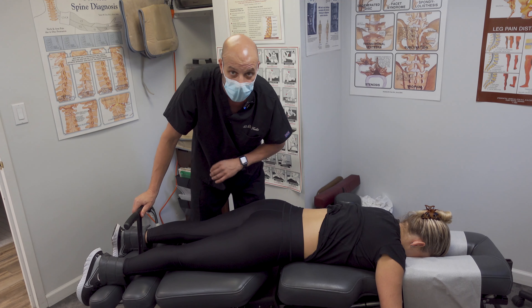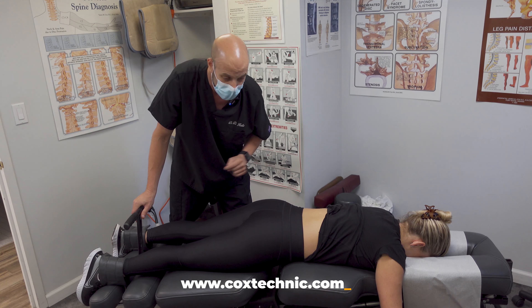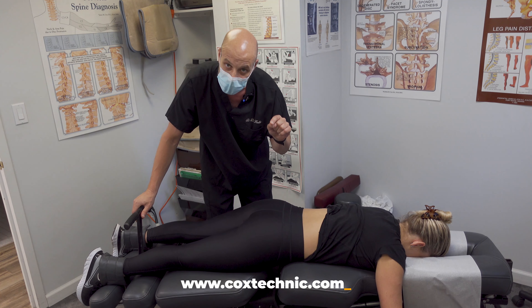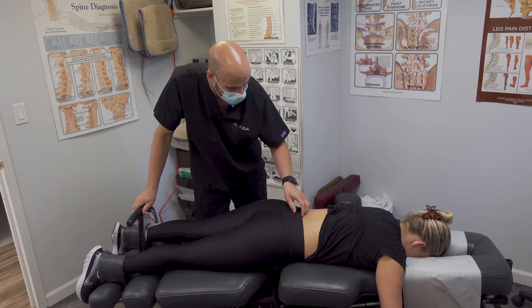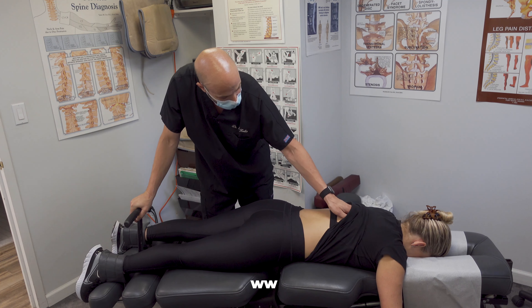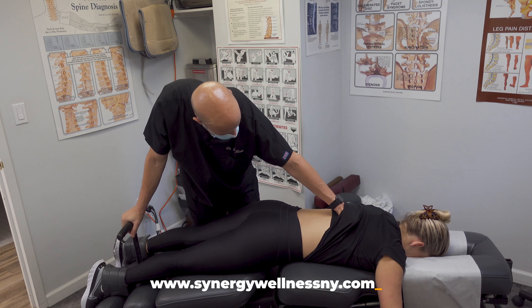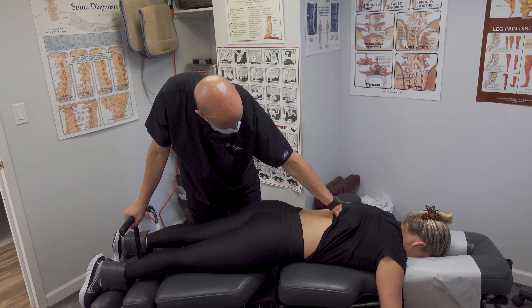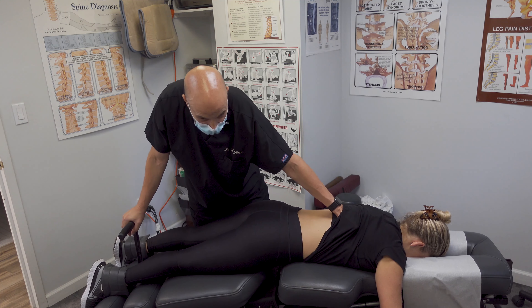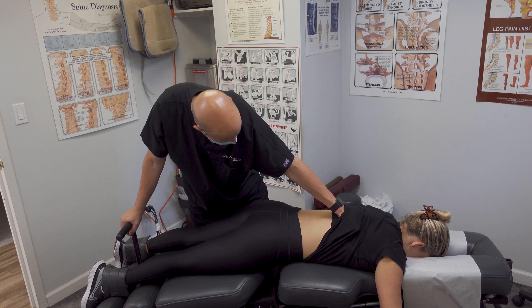If you suffer from a disc bulge, disc herniation, spinal stenosis, or pinched nerves in the lower back or neck, Cox flexion distraction technique is the gold standard. Most of the research is out of Indiana University. There's a ton of research on their website — Cox technique spelled C-O-X-T-E-C-H-N-I-C dot com. You can also go to our website at www.synergywellnessny.com. I place my hand up high to start for a reason — if she has herniations in the upper low back, I could make her worse.